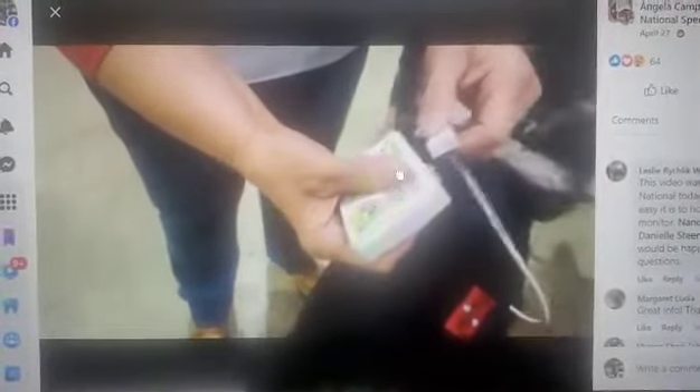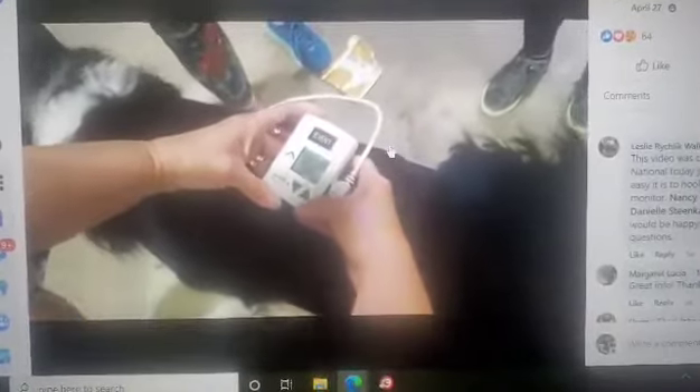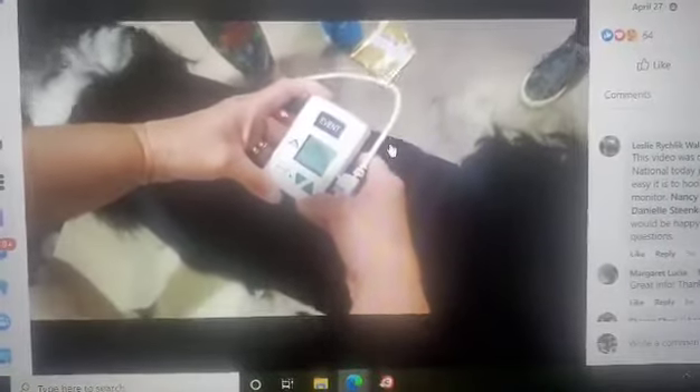Try to get your wires up underneath here because they'll poke out. It'll ask you. So it says this has been used before — there's a lot of data — and so you're going to erase the memory on it. So you go, then enter. Yes, you want to erase it. Erase. That's erasing the last recording.